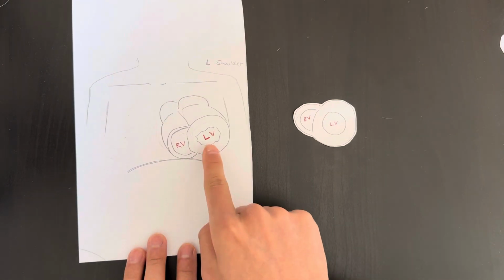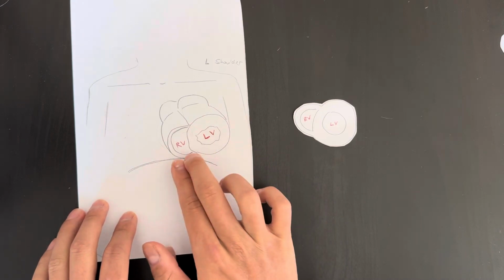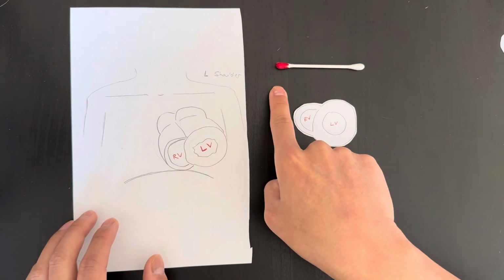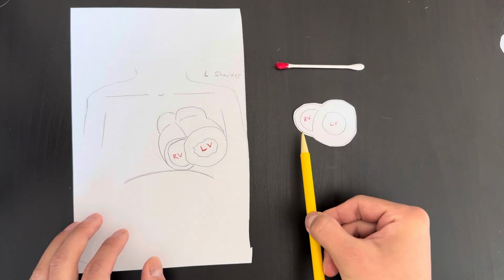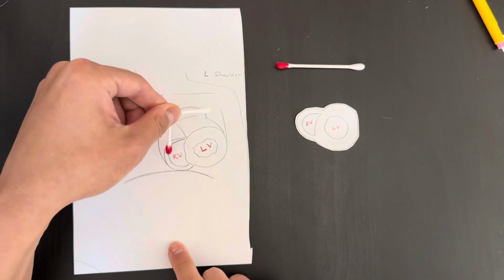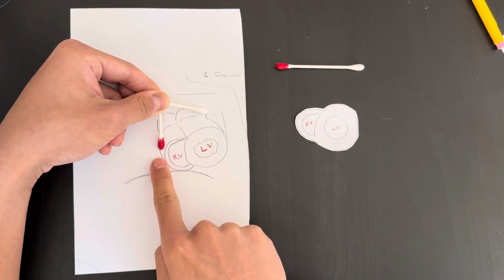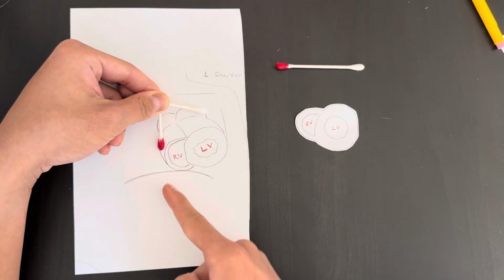If I was staring at my patient, looking directly at them, their LV would be on my right side and their RV would be on my left side. So if I had my machine settings in a traditional POCUS view where the marker is on the left, notice in this view, the probe marker is on the same side as the RV, or the patient's right. So to create this image, I would bring my probe, kind of diagonal on their chest, towards their RV, all right? So when the marker is on my left, I point towards my left. A better way of thinking about it is when it corresponds to the right side of the patient, I'm scanning with the probe marker to the right side of the patient.